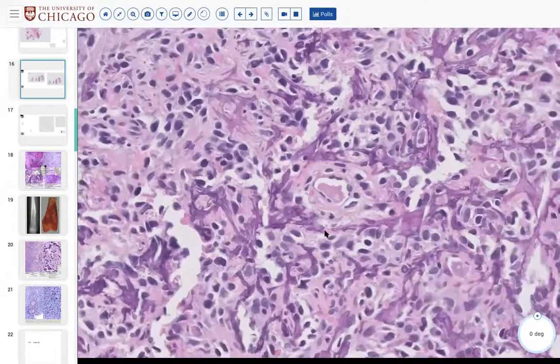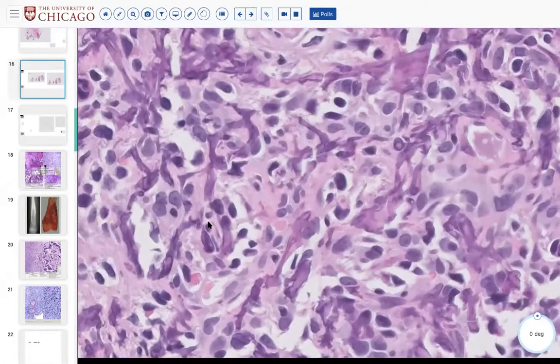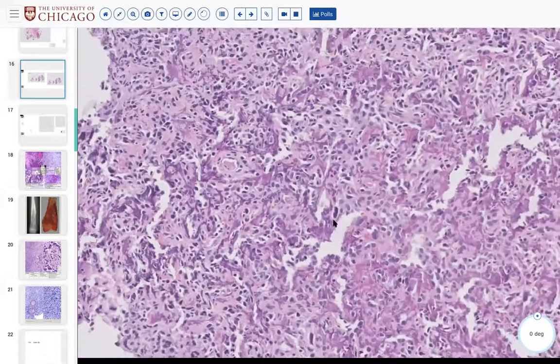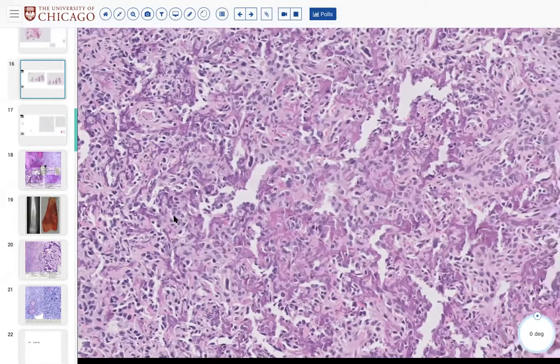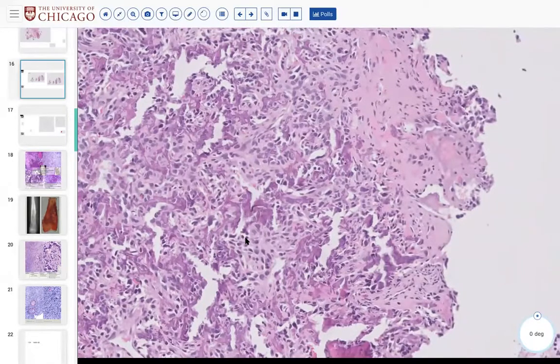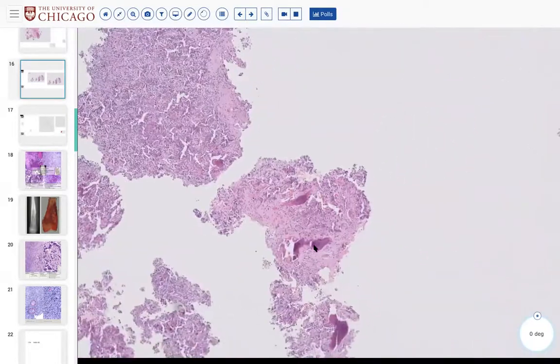Just gonna look. Yep, enlarged and dark, enlarged and dark, enlarged with nucleoli. And so, oh yeah, actually here's a good area, right? So there's a randomly enlarged one. There's a nice randomly enlarged one. And so not only is there diffuse sort of nuclear enlargement, but there's also this interspersed kind of patchy random hyperchromasia.